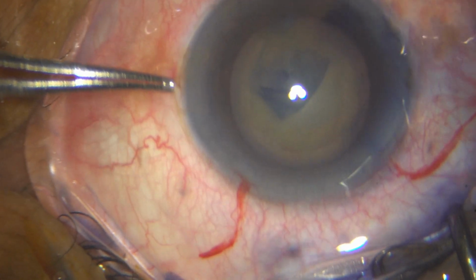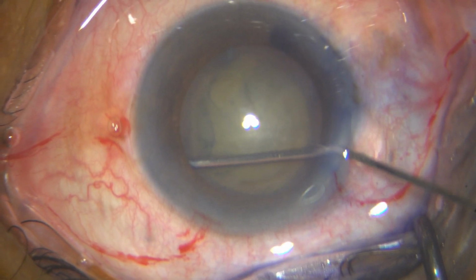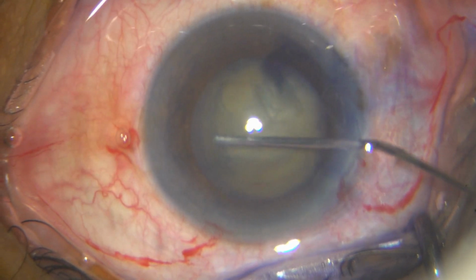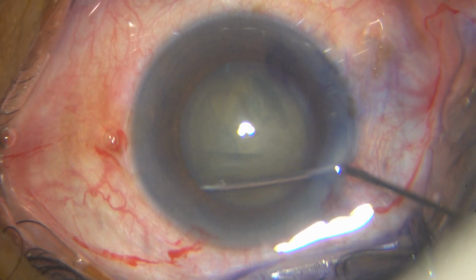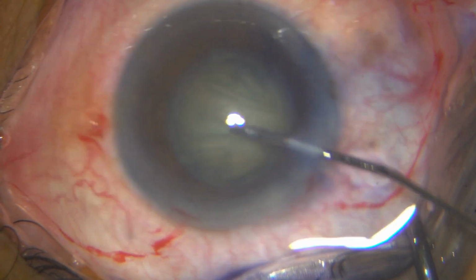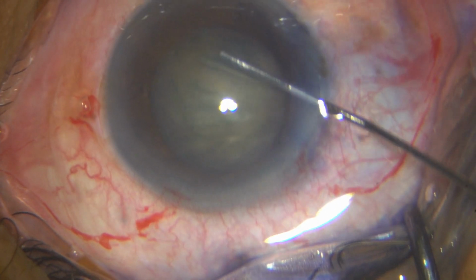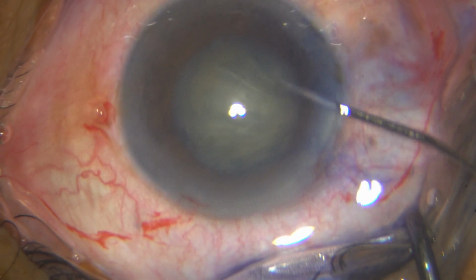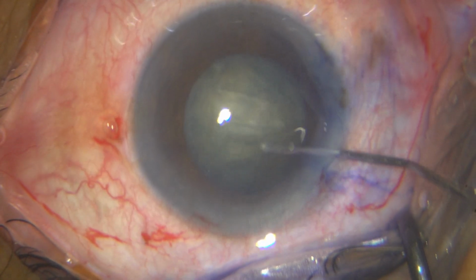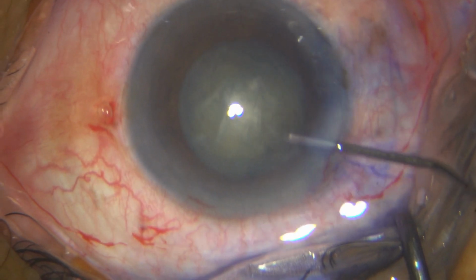After which I go ahead and perform hydrodissection. In these cases, I just look for the nucleus to epinuclear complex to come forward. You cannot see the fluid wave behind. Sometimes you may have to do it 2-3 times to make sure, and then I rotate the nucleus with the tip of the hydrodissection cannula. And once it rotates, I know all the adhesions are severed. That is, all the capsulocortical adhesions are severed.